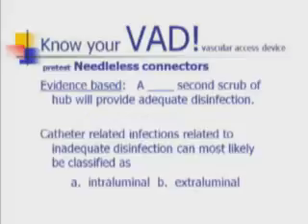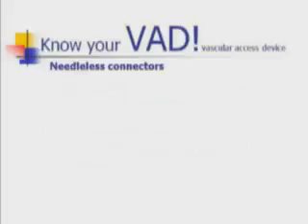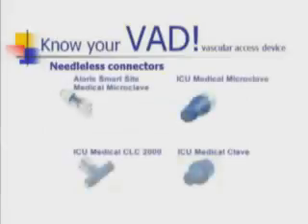Take a moment to contemplate these questions. Needleless connectors were originally designed and manufactured to protect clinicians from needle stick injuries. They may appear to be simple devices, but have complex design issues that may make some more prone to cause occlusion and others more prone to cause infection.